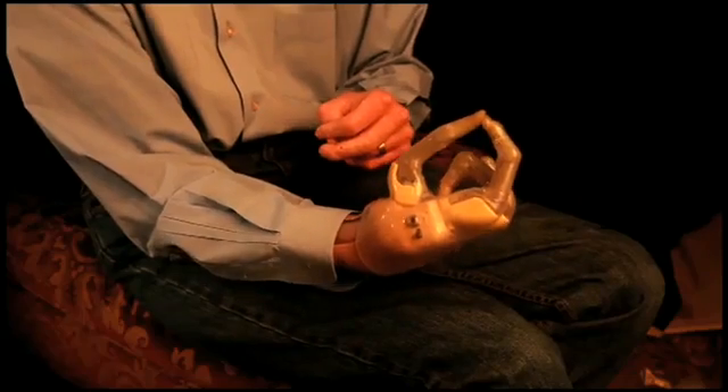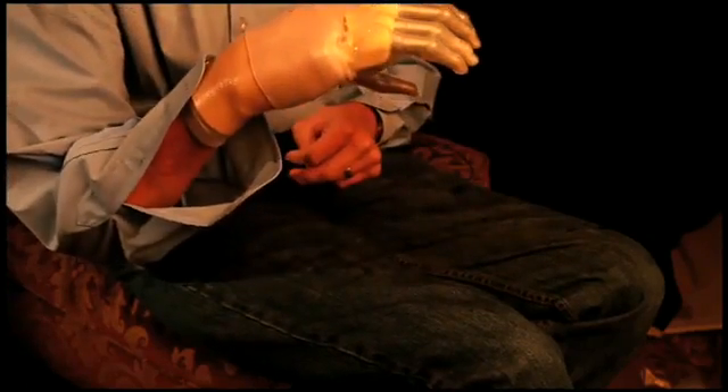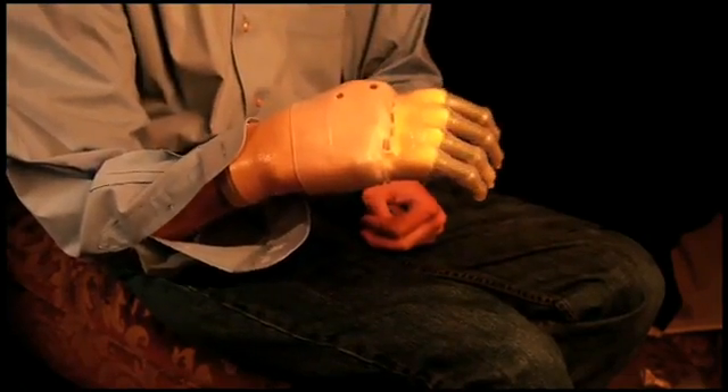The hand is very easy to use. It's very easy to put on and take off. It charges very quickly. The technology really is amazing. And the folks at Touch Bionics tell me that it's only going to get better, and I can't even imagine anything more awesome than this.